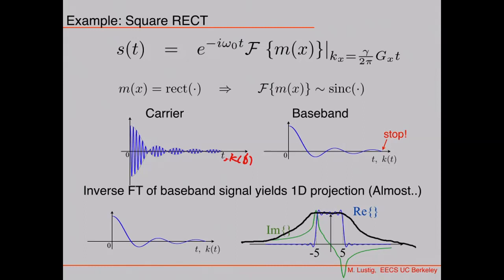You're absolutely right. If m of x was real, then its Fourier transform would have a conjugate symmetry. That means that knowing half of that signal, I know everything I want to know about the other part, right? So computing a Fourier transform and taking the real part is exactly the same operation. Okay, that makes sense. And so then you could see that the real part is actually the image. I see. This is also called half Fourier imaging. It is actually done in practice in some cases.